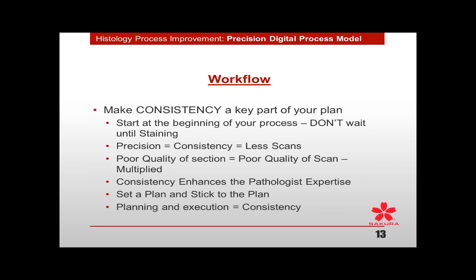Poor quality of section means poor quality of scan. This digital scanning is not going to be able to correct or make better any deficiencies we have in our process. Poor quality of scan, it's probably going to be multiplied because there's so many different ways you can manipulate that digital scan. Consistency will enhance the pathologist's expertise. That's true whether we stick in a digital scanner or not. And then again, you have to set a plan and stick to the plan. Planning and execution here is very critical, and that will help you create that consistency.